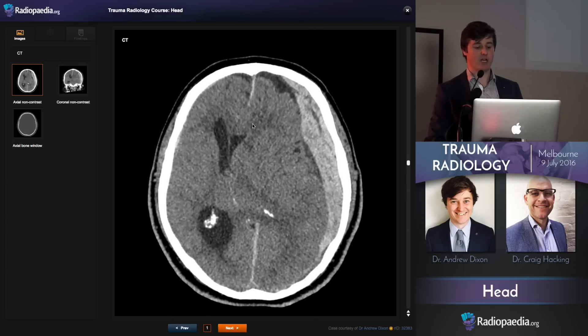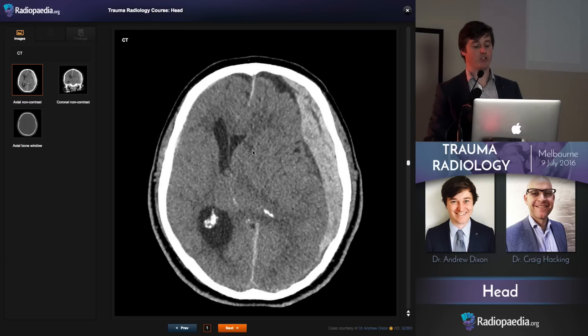You want to measure that midline shift — get the anterior falx, posterior falx, and then measure out from that midline, where the midline should be, out to the septum pellucidum to get a measurement of that.